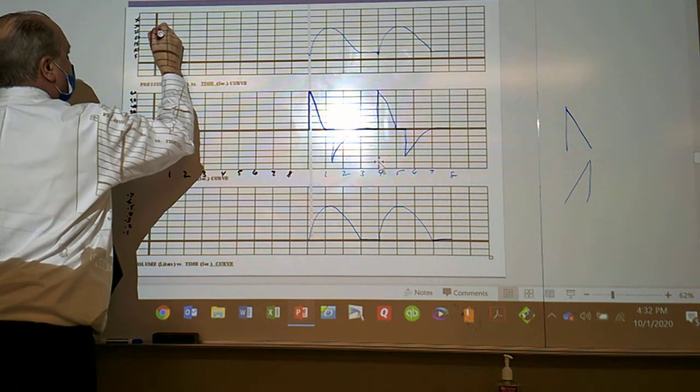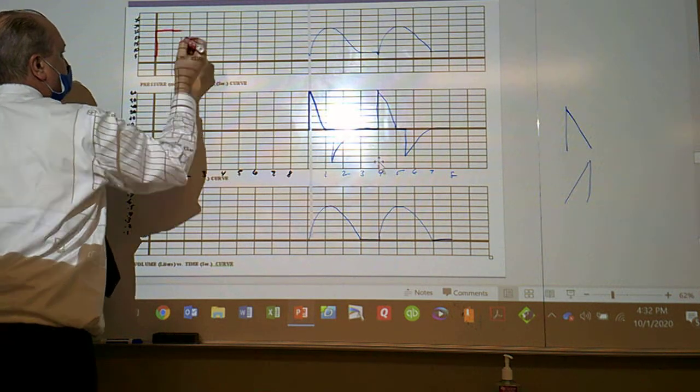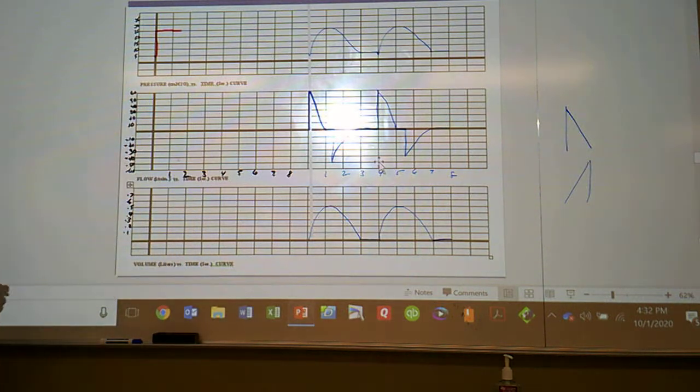When I saw your videos, I wasn't here, and you said that you can add peak pressure plus PEEP. How does this thing work? It should say peak pressure observed or peak pressure set. So let's just say it says observed. This is confusing already. If we have this on the exam, where do we have to put it? On the exam, I will say either observed or set.